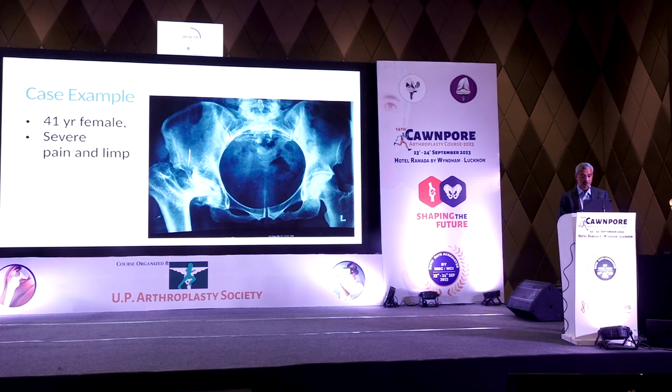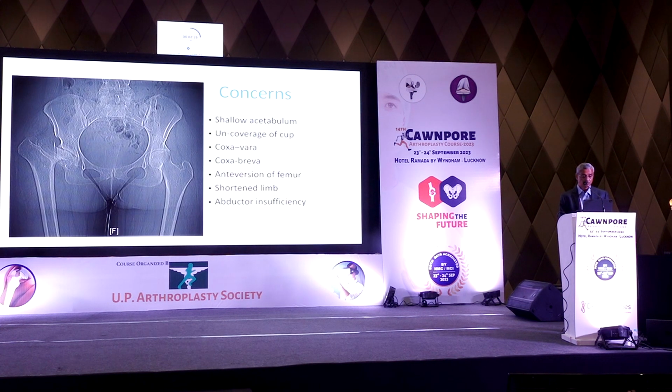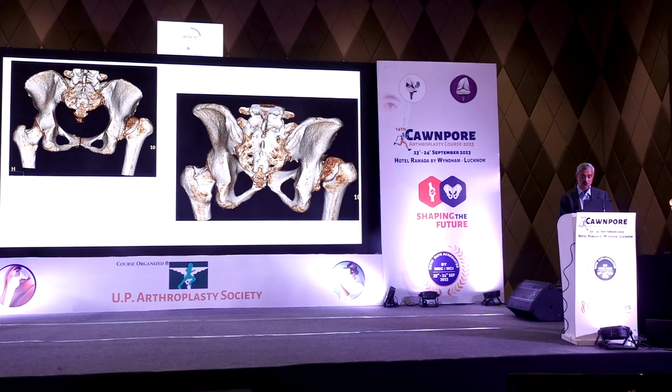So here I would have expected a very difficult scenario with this sort of presentation, a tight or very severe Coxa vara with a high riding greater trochanter. And all these problems are there. You think about that, you plan about that, how to go about it, you have your armamentarium, and then you go about it. You get your CT. It is absolutely mandatory in such situations.